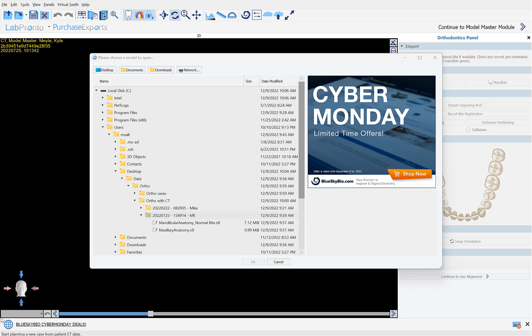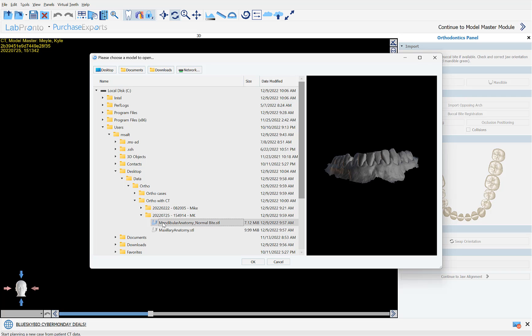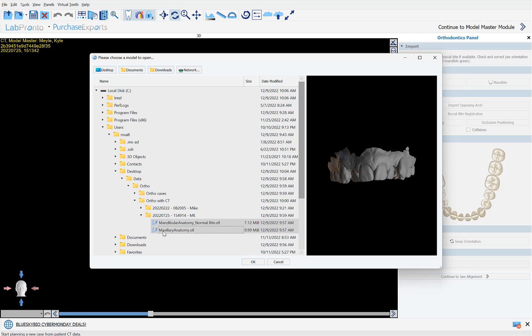Continue by navigating to the location of the relevant model scans on your computer. You can multi-select the relevant scans by holding down the shift key, left clicking to highlight them in gray, and then click the OK button.